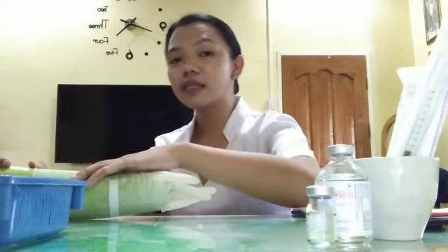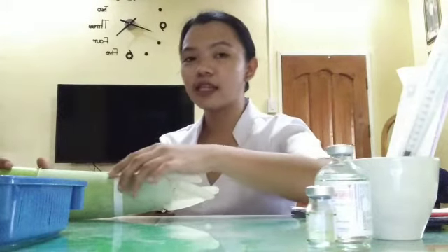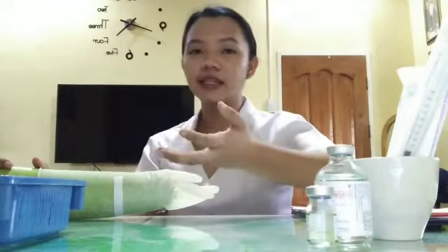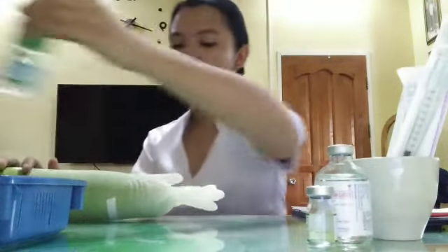Okay, so it seems that the site is safe, or it is okay to administer the injection. So next is we will clean the site.